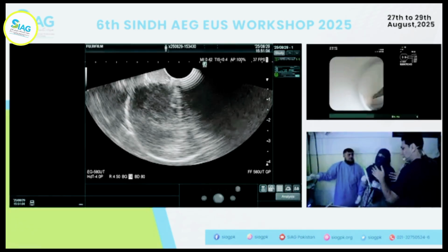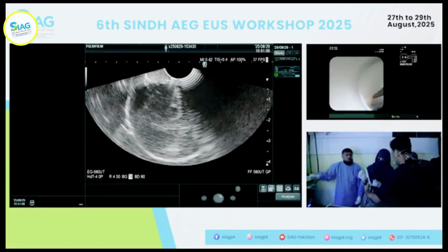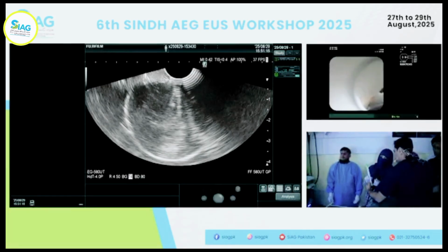That's fine. That's learning. It's good to do it here rather than on an actual patient. Okay, so our learning here is that we don't want too much sheath out. This is good. You can see a little bit of it, which is fine, which is enough.